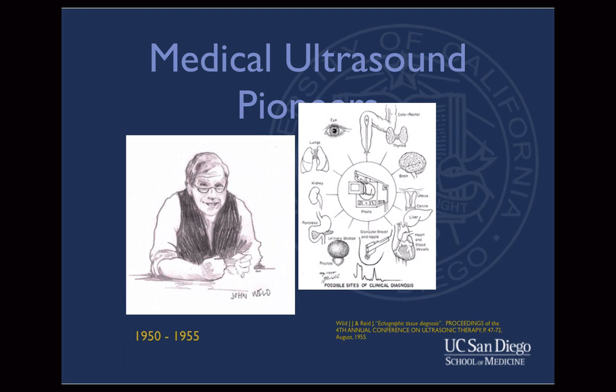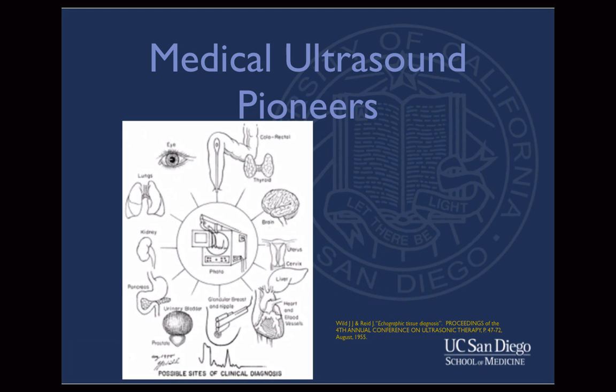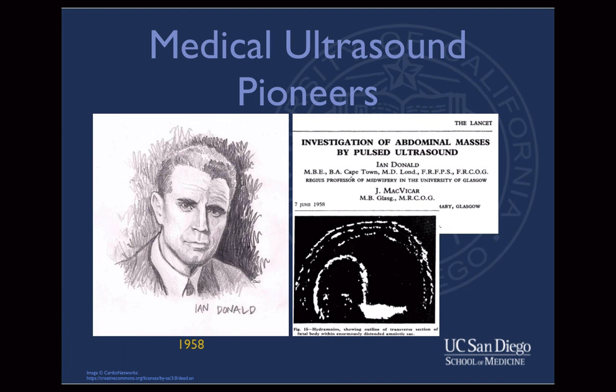By 1955, however, Dr. Wild was already well ahead of his time, creatively foreseeing a variety of applications using ultrasound in the clinical setting. Other groundbreaking publications in diagnostic ultrasound include the use of ultrasound to record heart wall motion and in the investigation of abdominal masses.